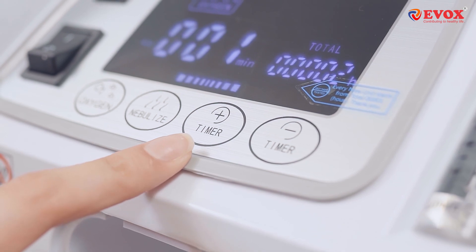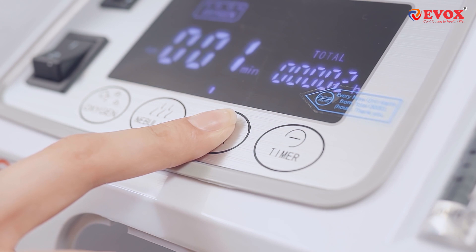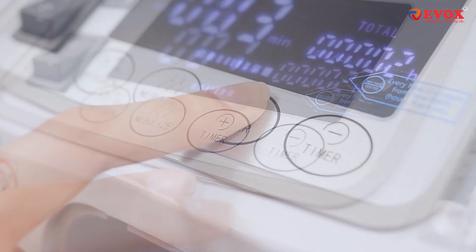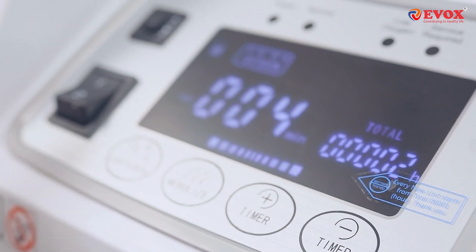We also have a special child lock feature in the Evox Concentrator. To activate the child lock, press the timer plus button until you hear a beep. Once you do that, a lock icon will appear on the display screen, indicating the lock has been activated.